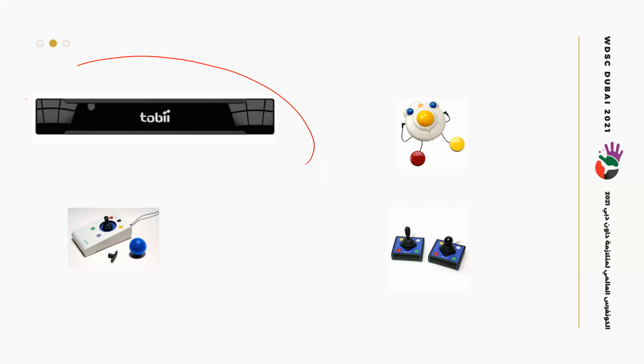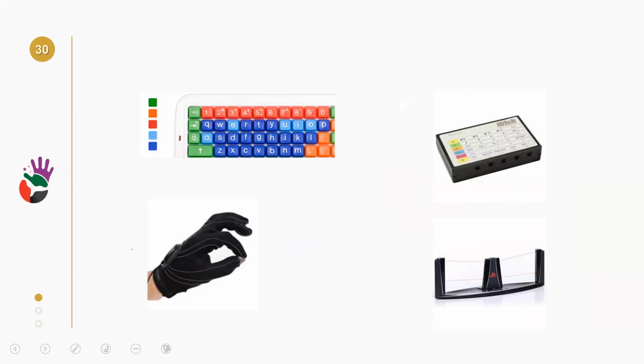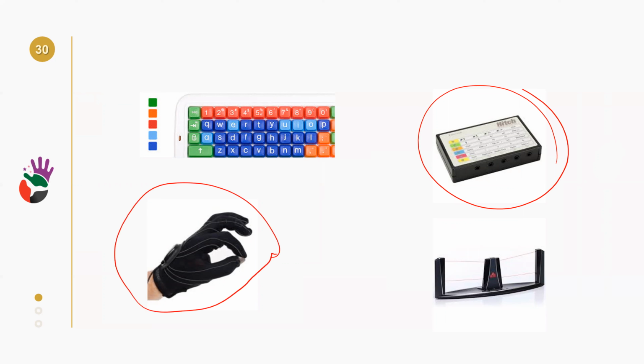And here, for example, is the eye gaze. We can also connect it to some software to improve different types of cognitive skills, depending on what we need. And here we see different types of mouse that we can also use. We also have a keyboard, or a hitch here, so we can modify the computer and make it accessible in different ways. If the child has significant problems in fine motor skill, we can use keyboard gloves, so he can access the computer through the gloves.